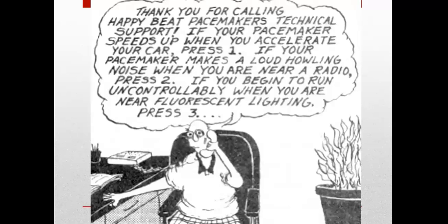Really new generation pacemakers and our automated defibrillators use the patient's telephone to gather data. And it's from special equipment in the home that they use, such as their scales, their blood pressure equipment. It's all connected. That information is sent to central monitoring systems that the manufacturer then sends to the cardiologist. So kind of like I was saying earlier, when we come in and interrogate it, we can pull months' worth of stuff and see what their rhythms have been running and whatnot.